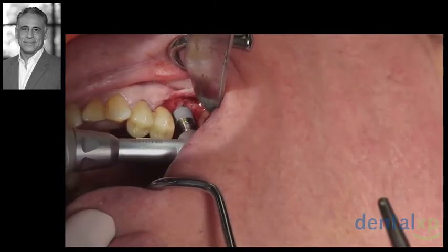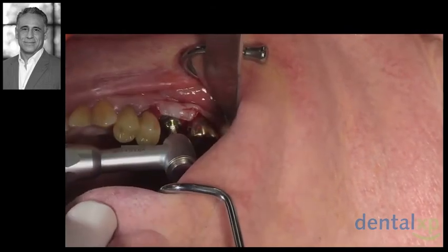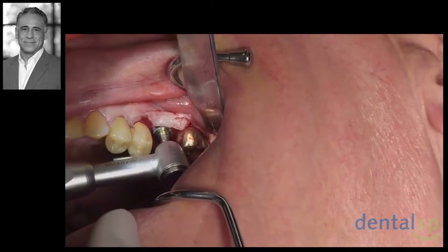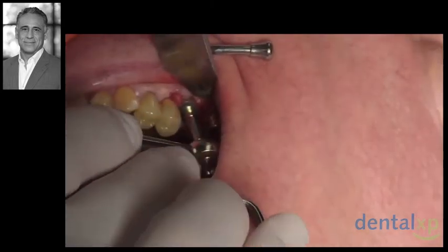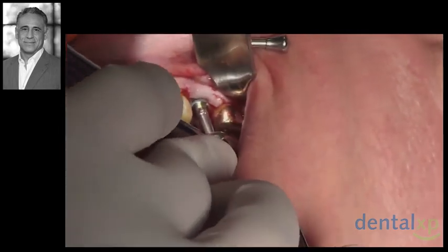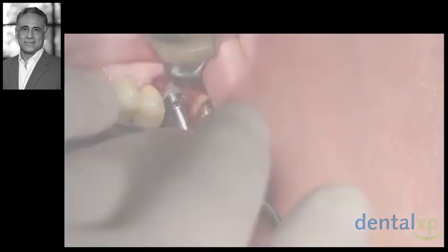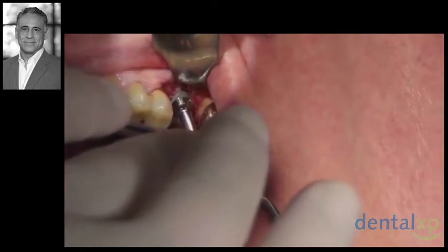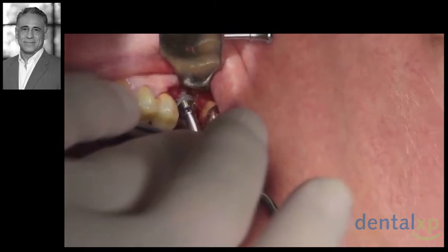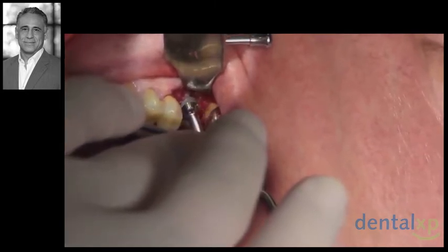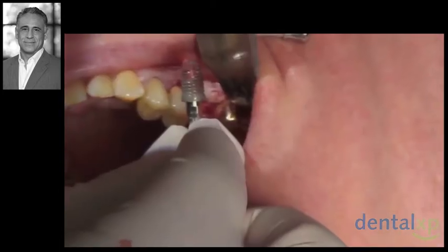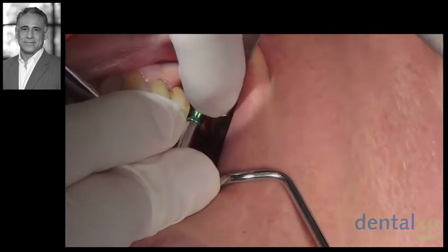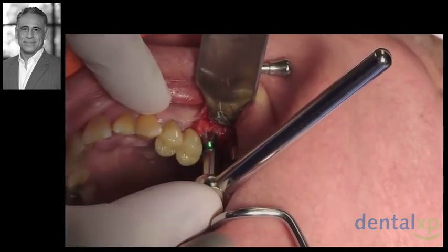Next, we'll place the implant. While the implant was being rotated into position, a very high resistance was noted when the implant platform was about 3 to 4 millimeters from the crest. This was a reflection of the great density of bone, most likely a D1 at this time, which we were able to achieve with the osteodensification process. To avoid excessive force and damage to the internal hex, the implant is backed out and removed. We'll then go ahead and modify the site further and prepare it for the implant using an implant bone tap.